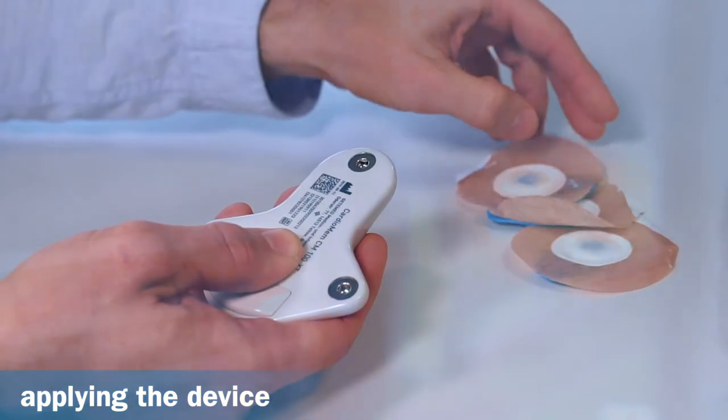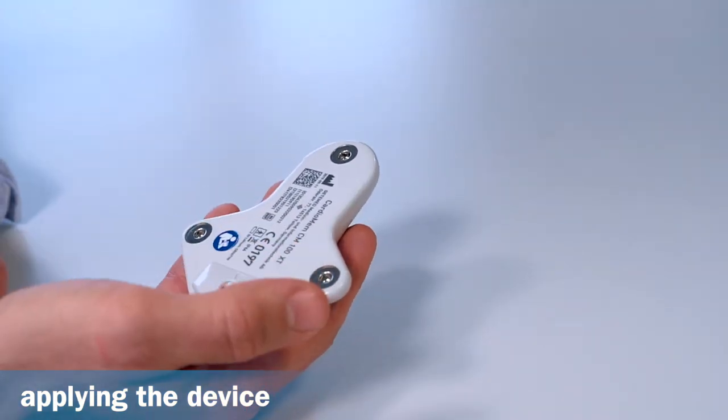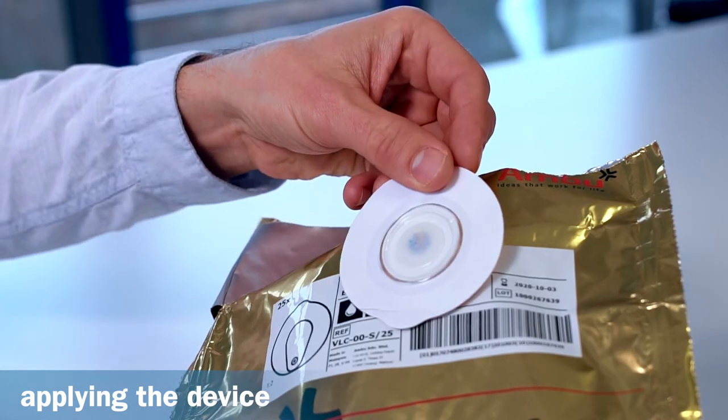Please note, the electrodes are for single use only and can be disposed of in the normal household waste after use. The patient should therefore be given a sufficient amount of electrodes to cover the planned monitoring period.